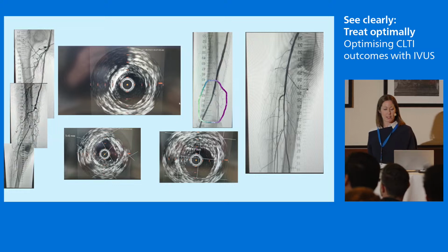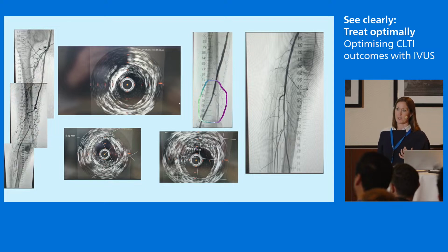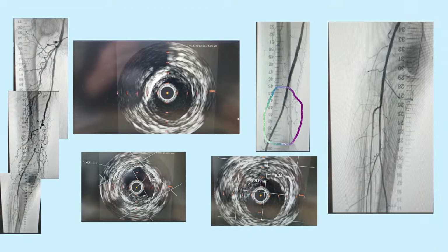So I suspect I may just have undersized the measurements to begin with. It's entirely possible that that's just a learning curve of sizing it. But looking at that angio, and again, the guys will say you transition from using angio and cross-referencing all your IVUS with angio as a learning curve to being able to just trust what you see on IVUS.